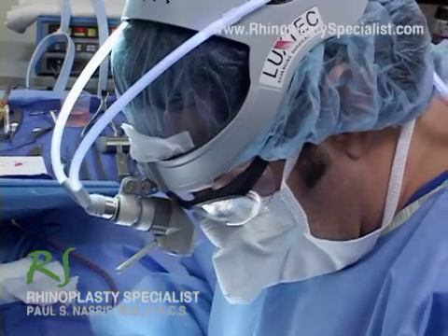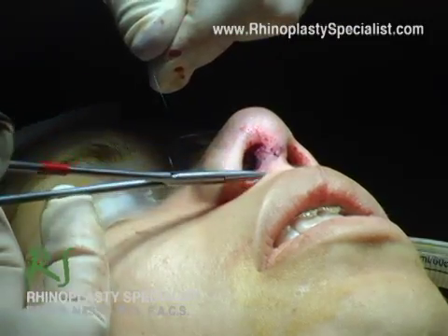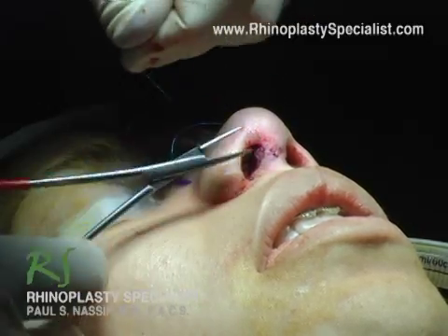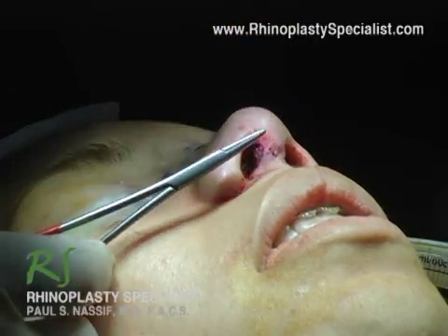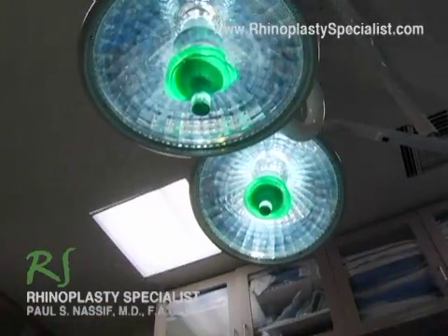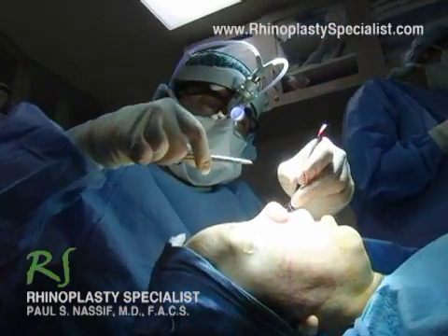Some of these sutures will be removed in one week; some of the other sutures I'm placing will stay in and dissolve on their own. In a few weeks this incision area should look fantastic. It may get a little red for the first few weeks, but after three or four months this scar should be nearly imperceptible.